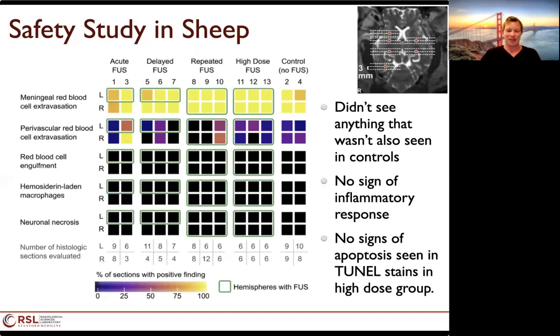No, that was perfect. Okay. Anyway, we didn't see anything on TUNEL stains either. So that's our safety study in sheep.